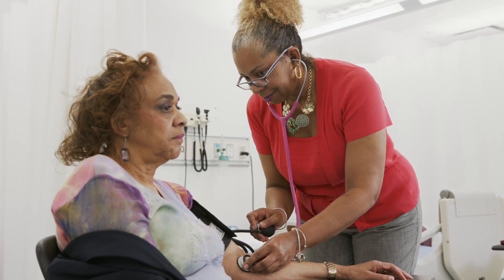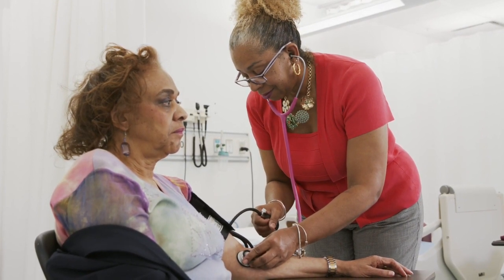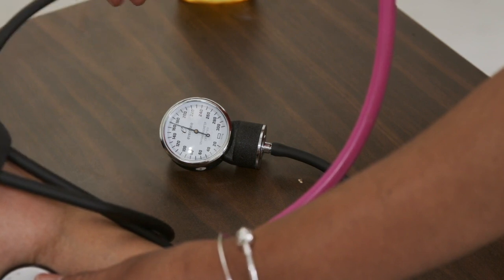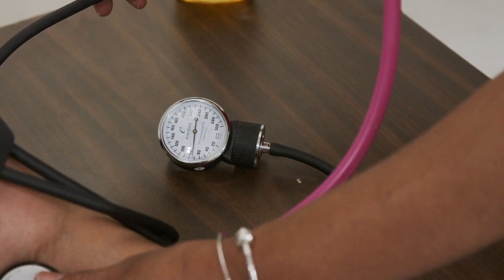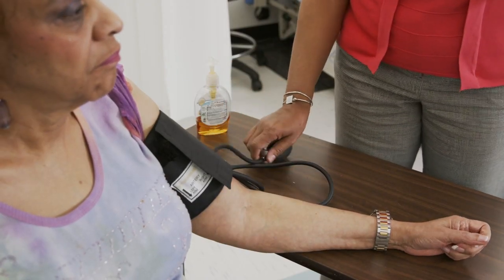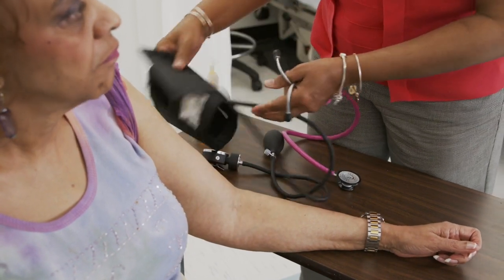You then inflate the blood pressure cuff by locking the screw on the bulb and squeezing the bulb to inflate the cuff. Once you no longer hear the pulse of the heart rate, you will stop inflating the cuff and slowly deflate it by loosening the lock on the screw of the bulb, allowing the air to be released slowly while listening through your stethoscope. The first sound you hear will sound like a thump, thump, thump, and that is your systolic blood pressure reading.